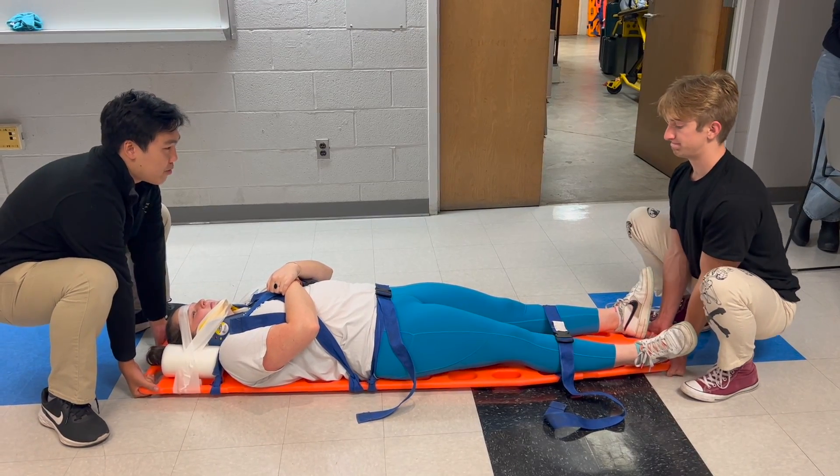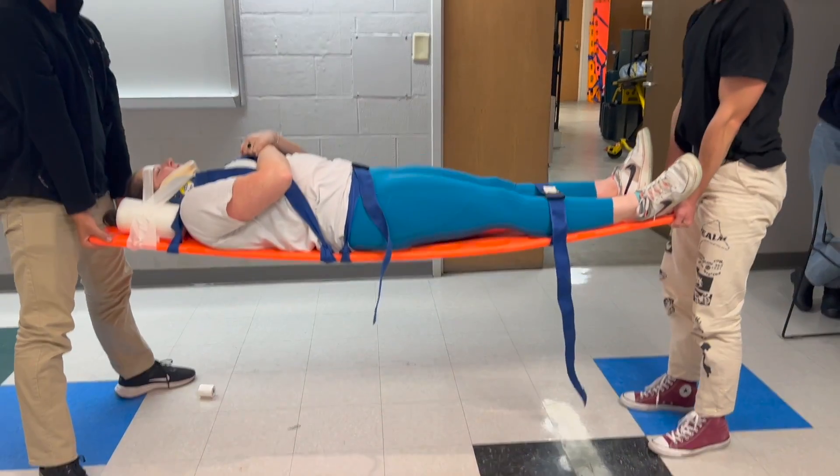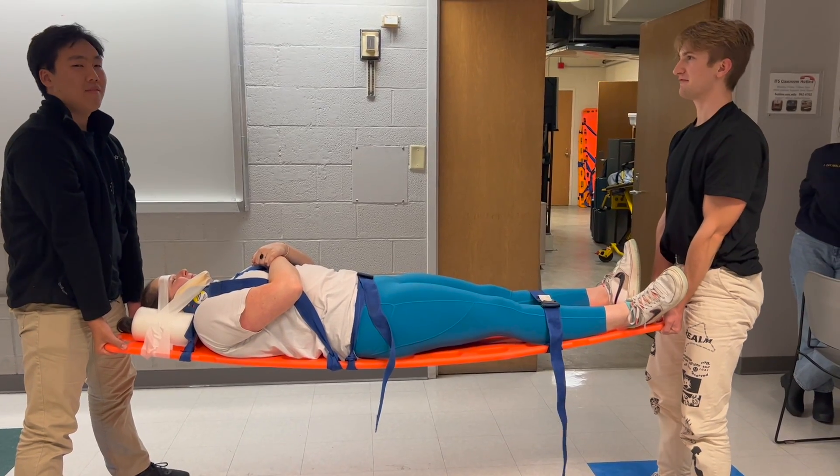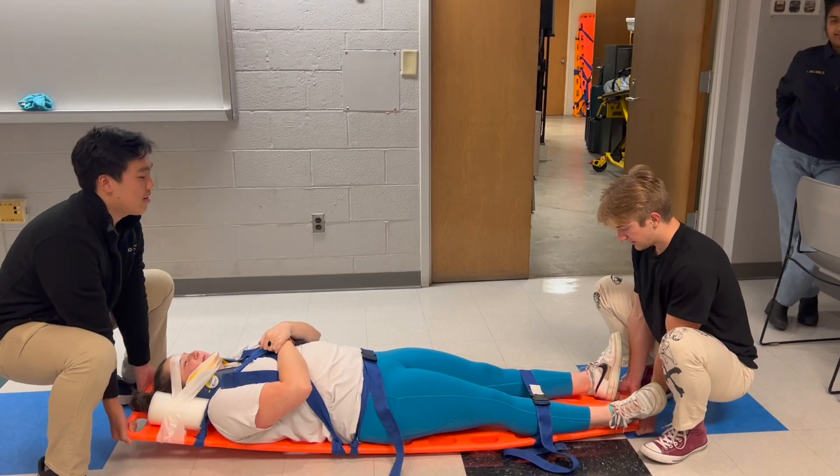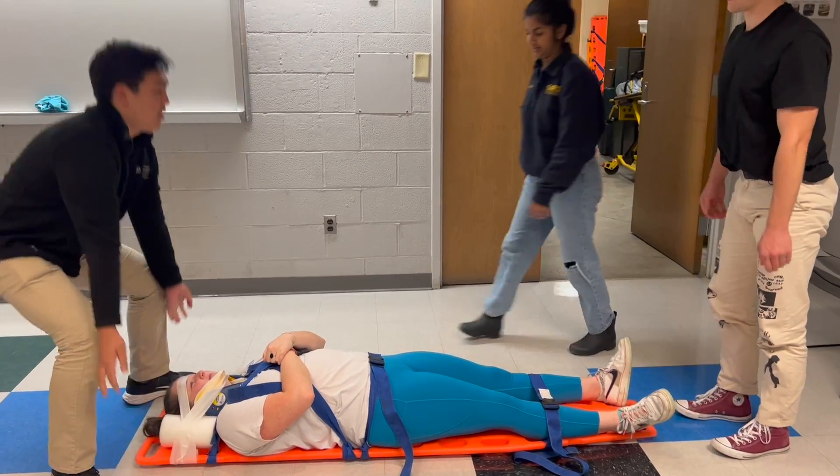Up on three — one, two, three, up. And down on three — one, two, three, down. And here we go with the four-person lift. It's very similar — same process. Make sure to use the big muscles in your body and not your back.